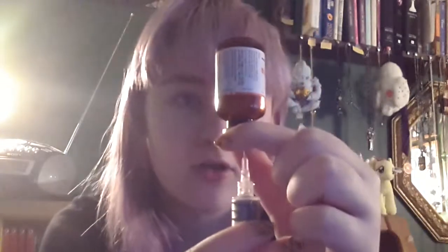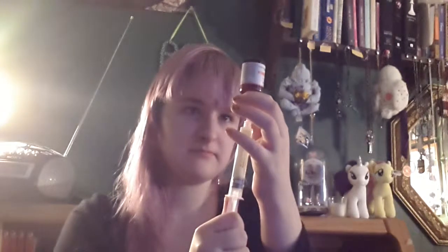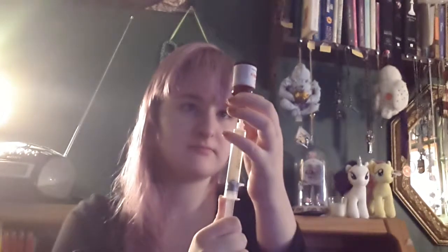Turn your vial upside down, and bring the needle down so that it's still at the side but at fairly the bottom. Then you're going to pull back on the syringe, getting out as much of the liquid as you can. There's a little bit left and we can go back and try to get that in a minute. Here's your syringe with the needle full of your doxy, or whatever you're using.